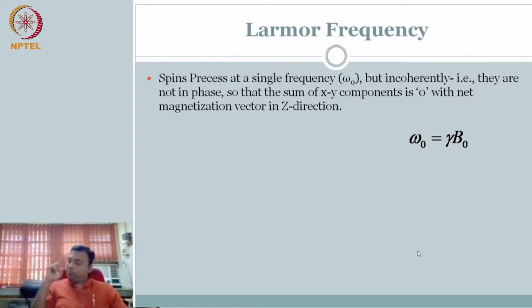But when you are spinning around this direction, at some frequency, which is called the Larmor frequency, given that you all are supposed to behave the same, you are all hydrogen, right? So no matter what happens, after some time is given, after the external magnetic field is applied, eventually everybody would have come doing this.